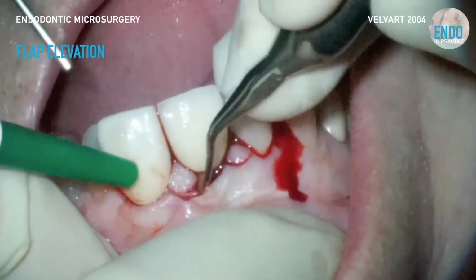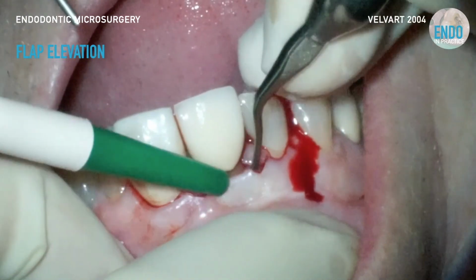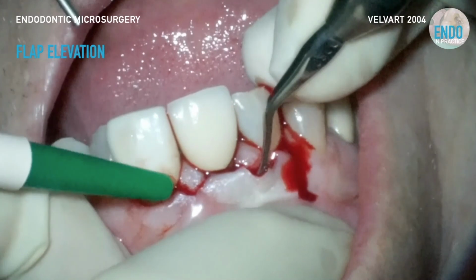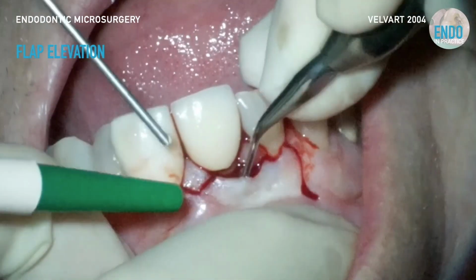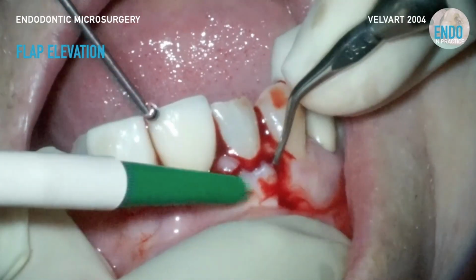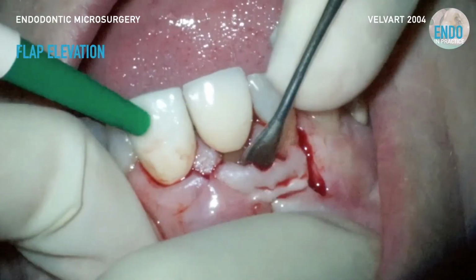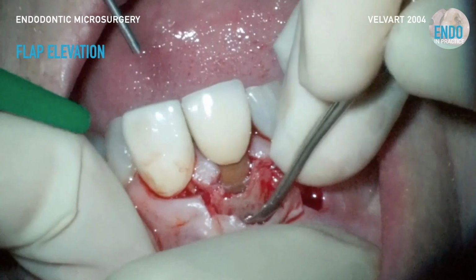To elevate it, because it's a small incision and you don't want to crush the papilla and cause necrosis of the papilla, you're going to need to use something pretty small. So I like an Allen's elevator, or this is just the backside of a spoon excavator, sorry. But can you see my nurse is constantly irrigating?